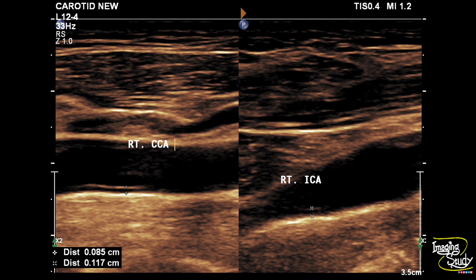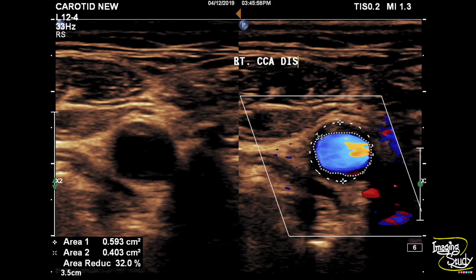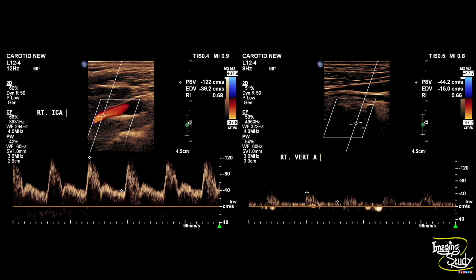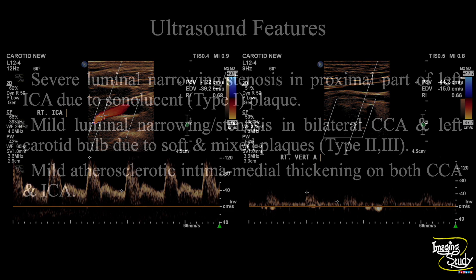Now let's check the right side. On the right side there was intima-medial thickening on the right common carotid artery and internal carotid artery, with mild luminal narrowing due to type 2 and type 3 plaques in the distal common carotid artery. The spectral Doppler shows normal flow in the right common carotid, external carotid, internal carotid, and vertebral artery.